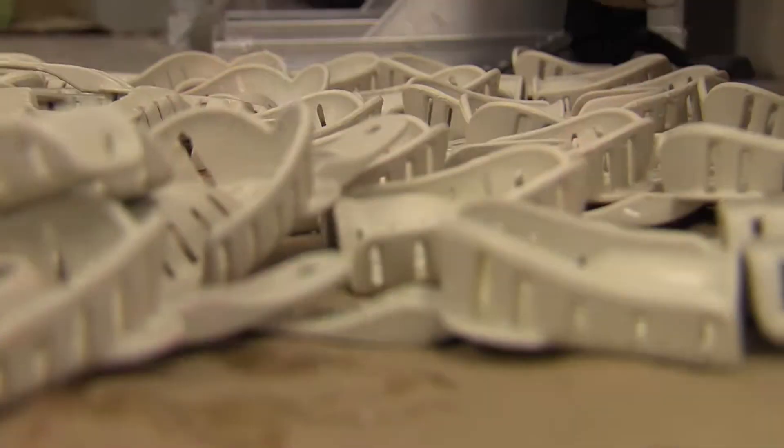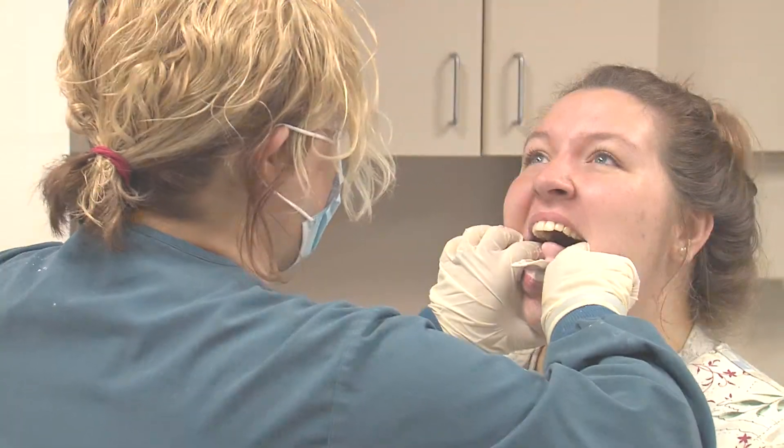What are all the steps to taking an impression? Well first you have to protect yourself, so you need a lab coat, mask, glasses, and gloves. You're going to try an impression tray in somebody's mouth, and then you mix alginate and put that in the tray and put it in their mouth.